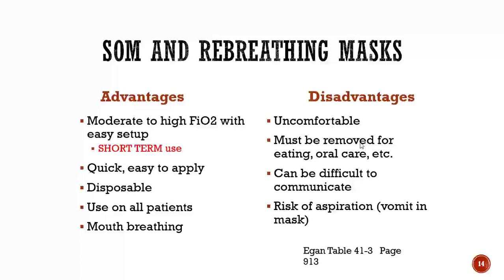There's also a risk of aspiration, and this is something that I've actually seen quite a bit. People wearing different masks, simple masks, rebreathing masks, CPAP masks, and then they're nauseous due to some of the meds that they're getting or the things that are going on. And if you throw up into a mask, you are more likely to aspirate it because it comes back into your mouth. So that's another disadvantage.